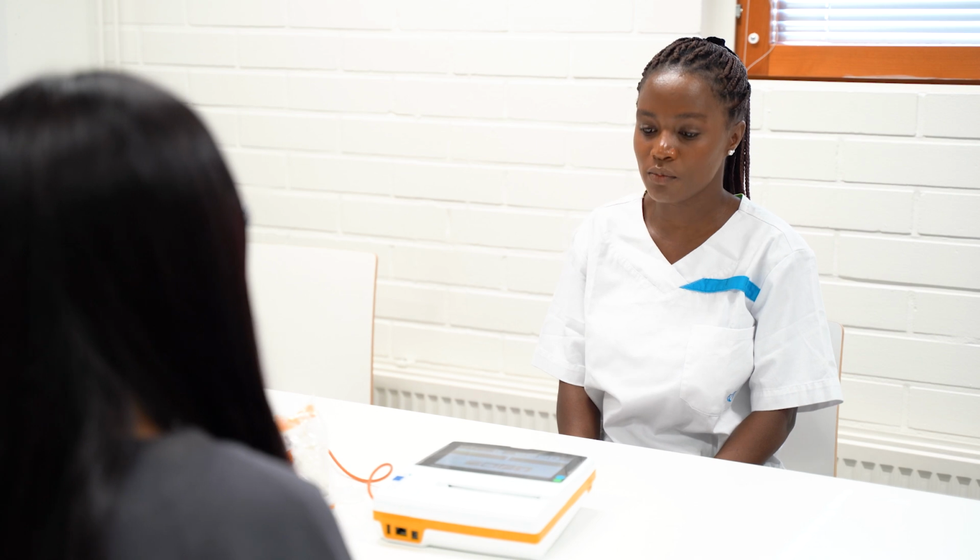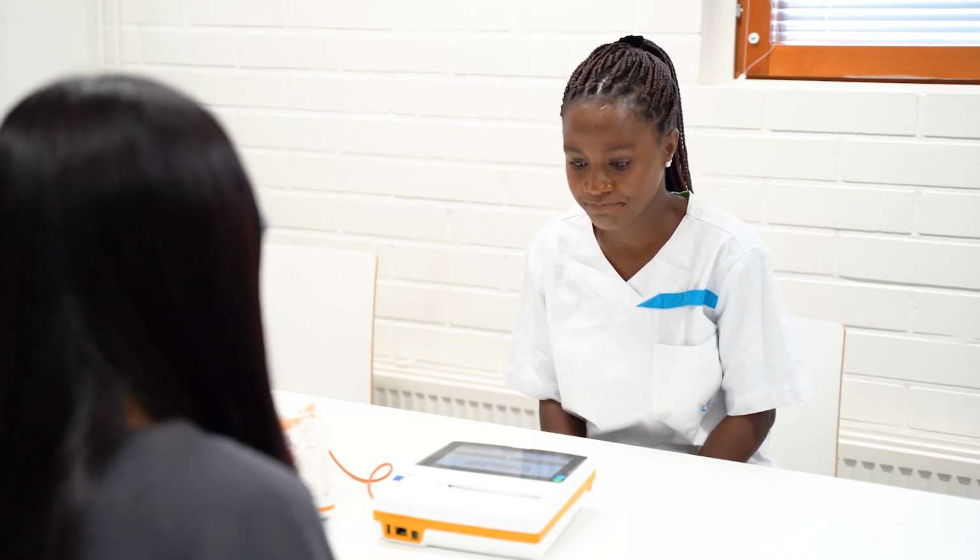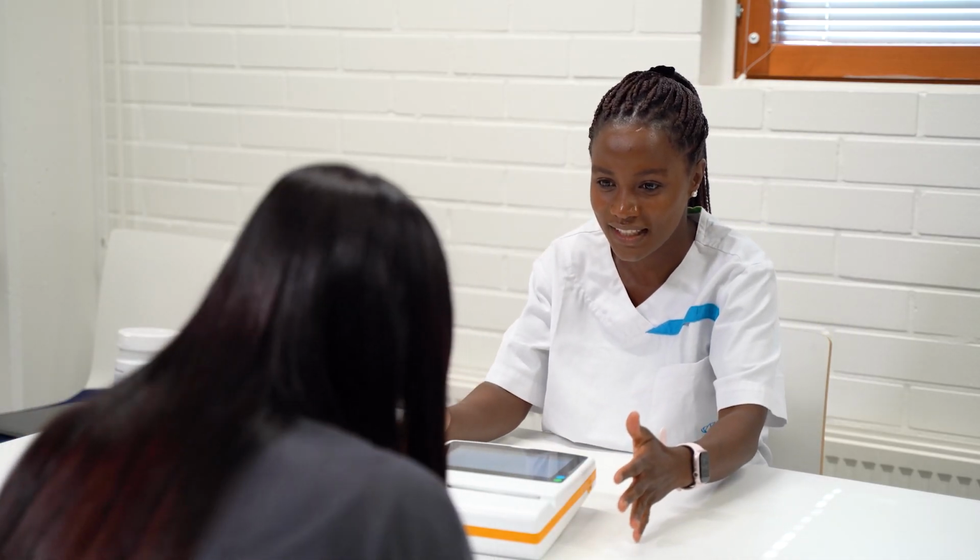Let the patient know what to expect during the test, including how long it will take and the importance of accurate breathing for reliable results. Ensure the patient is comfortable and seated properly with an upright posture for optimal lung expansion. Instruct the patient on the breathing techniques: normal breathing, maximum inhalation, and forced exhalation into the mouthpiece.